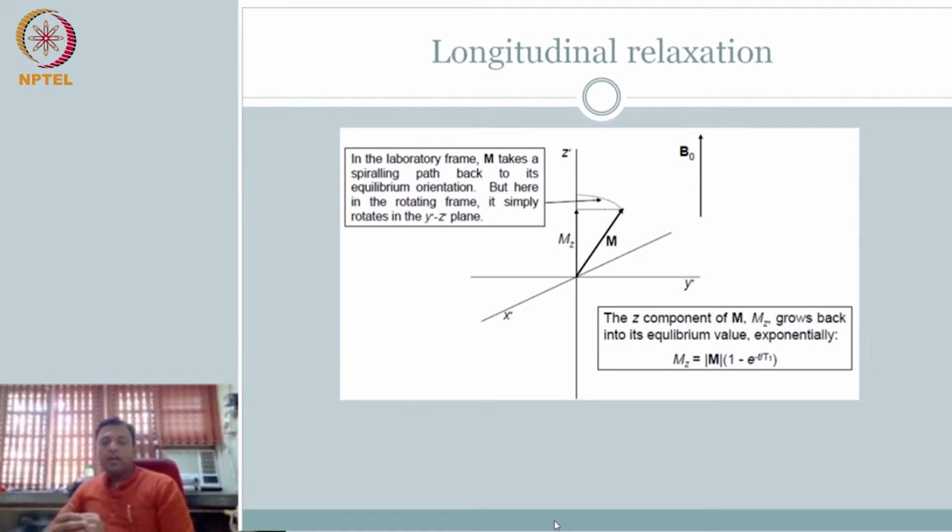Now you recall we talked about, of course you have to apply an excitation pulse. I mean, you have to have an additional excitation pulse. That's a given. So now the question is, how will you apply the excitation pulse, since the spins are already on the floor, right? What are you going to do? If I apply another 90-degree pulse, it will go down. No transverse component. So it doesn't make sense. Right? So what will I do?